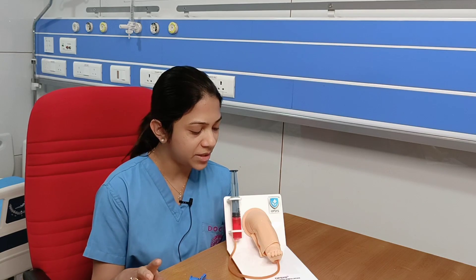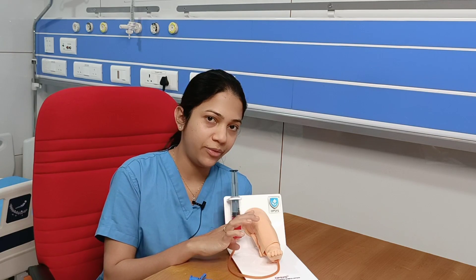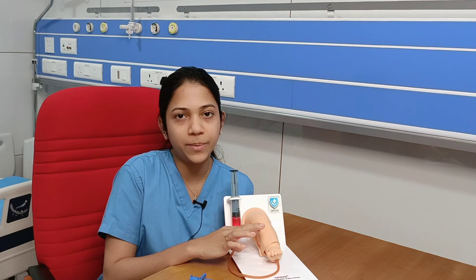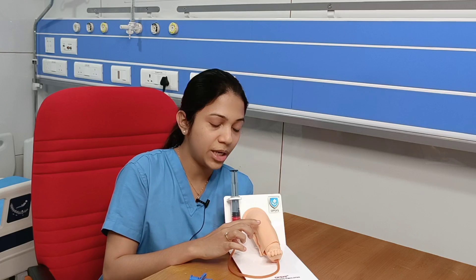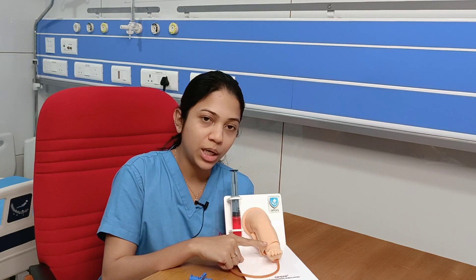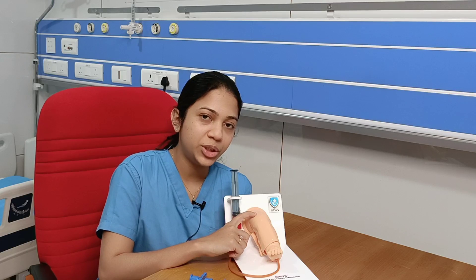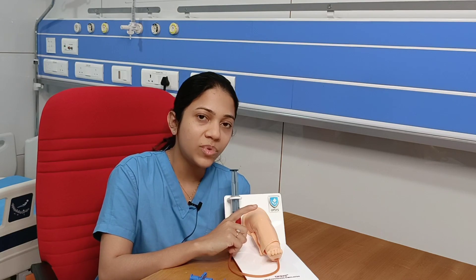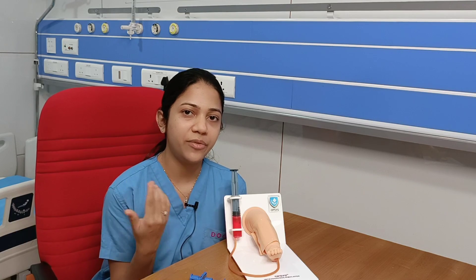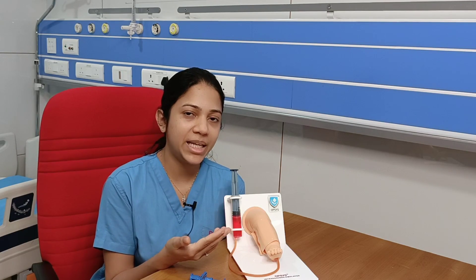Regarding sites: we can go for the proximal tibia, distal tibia, or distal femur. The proximal tibia drains into the popliteal vein; the distal tibia drains into the great saphenous vein; the distal femur drains into the femoral vein; the proximal humerus drains via the axillary vein; and the manubrium sternum drains via the azygos vein or internal mammary veins.